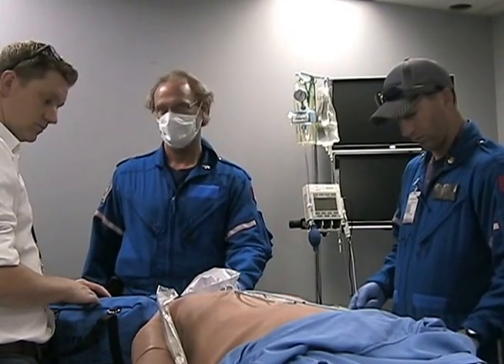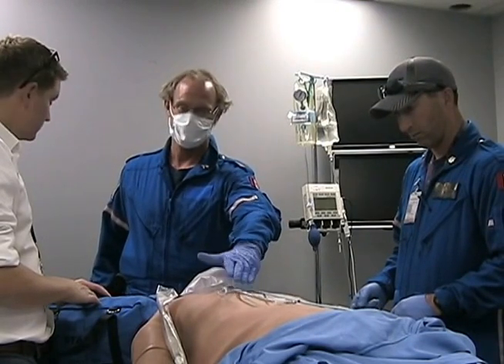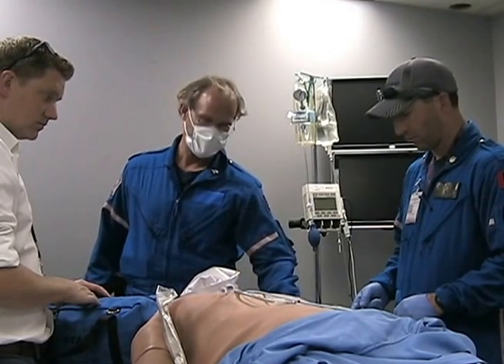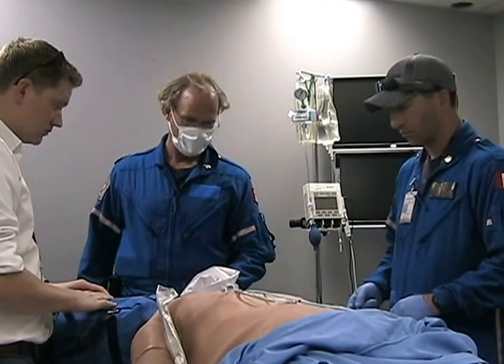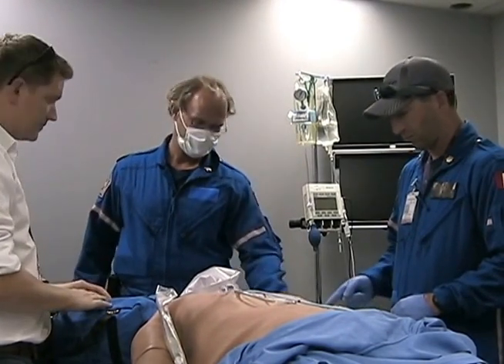Okay. ET tube size, cuff tested, syringe on, lubed, bougie, plus or minus stylet. Yes, James did that. Okay. Backup airways, LMA, King LT, Crico kit. LMA is here. Crico kit is just done by James, and I've talked to him about that. End tidal CO2 initialized, working. Yeah, James got that going. ETT holder. ETT holders here.